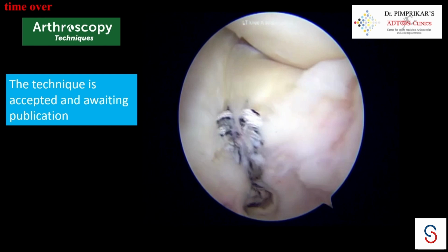We fix this at about 90 degrees of flexion. So in extension, it does not create any issues. In flexion, it might. But until now, it hasn't caused any. But your concern is absolutely right. But then in a similar fashion, these PDS sutures also might give way because the capsule is so thin and flimsy there that most of you will agree with me that you are never confident after doing an outside-in repair for the anterior capsule.